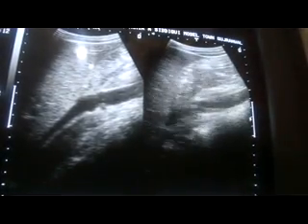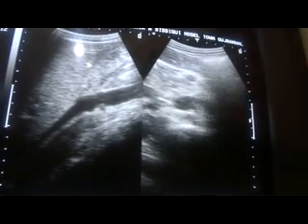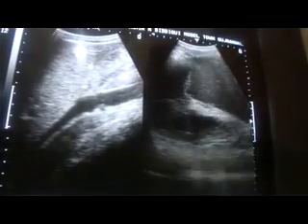See the curvature of the IVC, because below, posterior to it, is the mass, if you see in transverse section. So is the IVC elevated is a question to be answered.